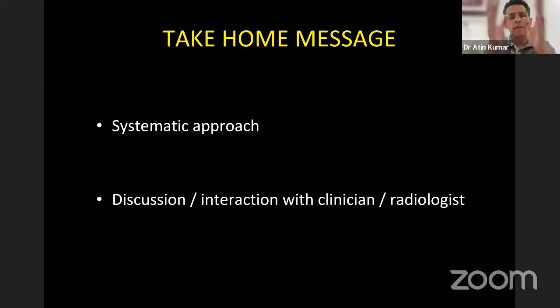It could have happened 5 days earlier, 7 days earlier, 1 month earlier, 2 months earlier. I cannot time it at that point, whether it was intranatal, postnatal, whatever. But if I have done diffusion, I can tell you that this happened within the last 6 days, 7 days, if it is showing bright on diffusion.